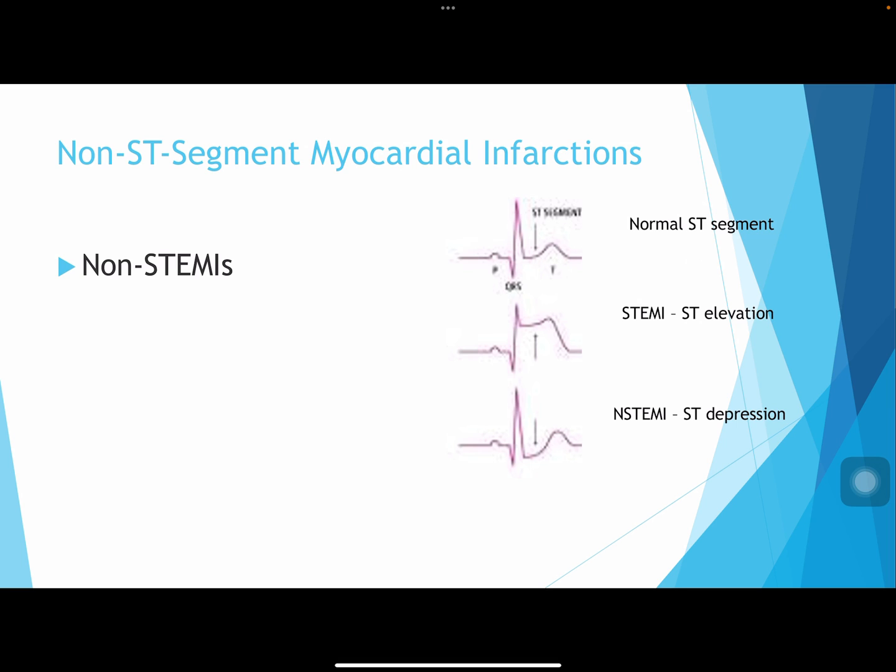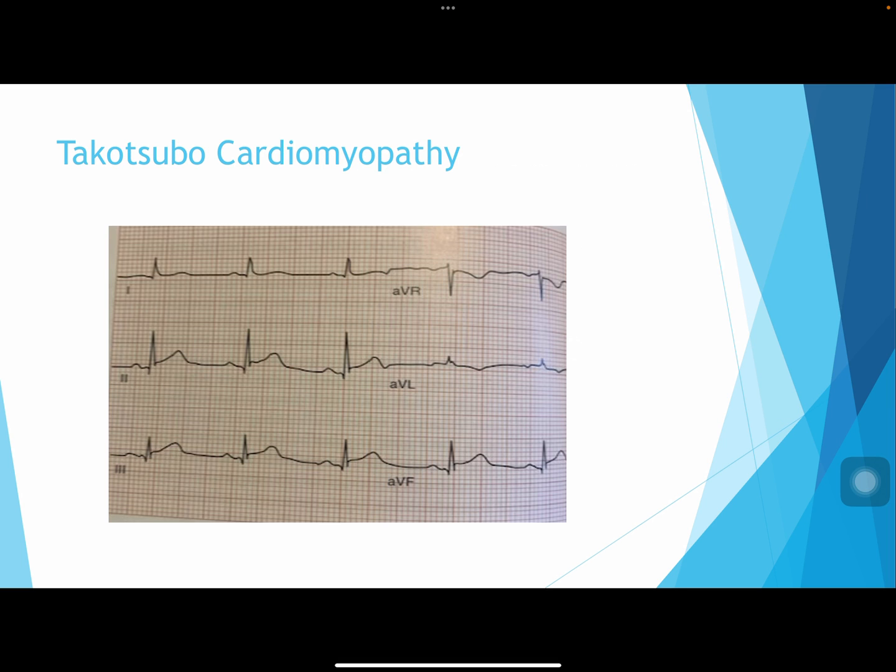So next slide, Takotsubo. So hopefully you guys are all very familiar with this. I feel like a couple of people have already had case studies like this. It's insane. This to me is just the body just being so powerful and the mind being so powerful. But this Takotsubo mimics an acute STEMI on the EKG. So, I mean, it has the T-wave inversions and ST segment elevation. So that's something that's pretty amazing.